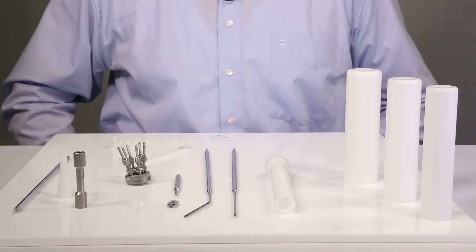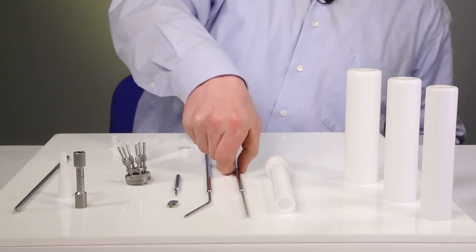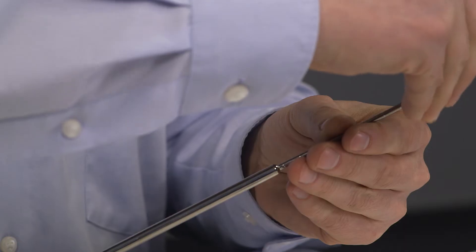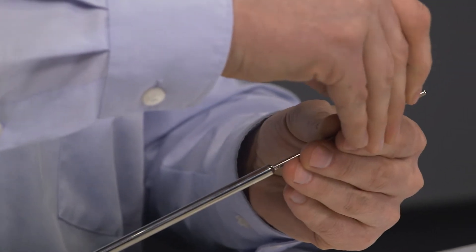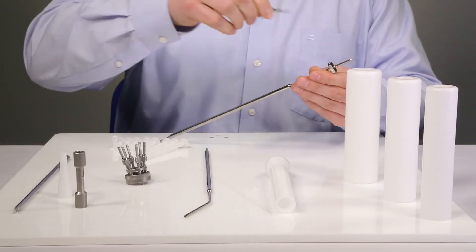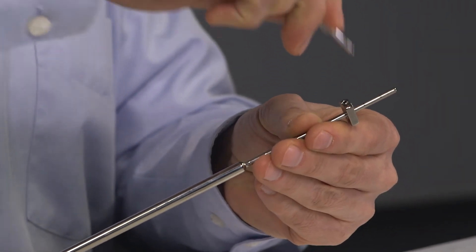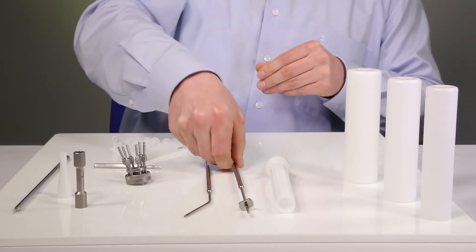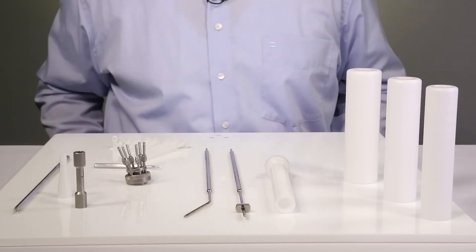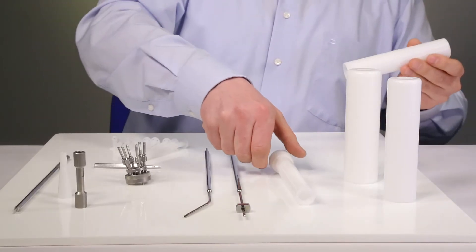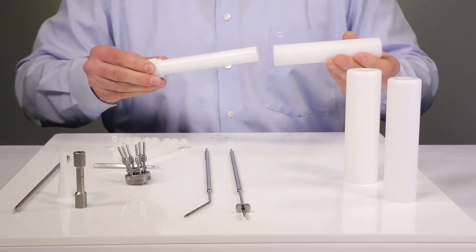Now let's start with the assembly. First I fix the cervical stop on the intrauterine tube. Now I select the small build-up cap and screw it onto the applicator body.